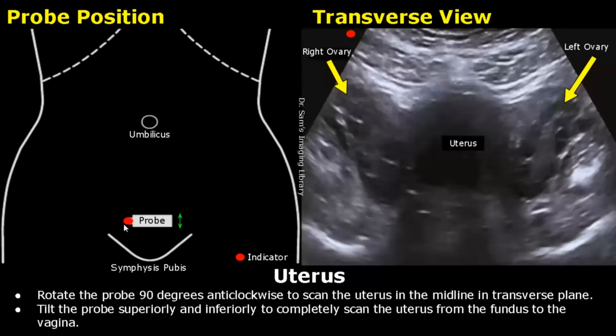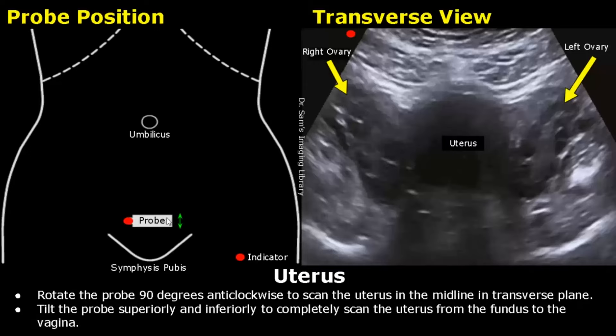Next, we will scan the uterus in transverse view. Place the probe in the midline and rotate it 90 degrees anti-clockwise to keep it in transverse orientation. Tilt it superiorly and inferiorly to completely scan the uterus from the fundus to the vagina. We can see the uterus in the middle and also the right and left ovaries on the sides.